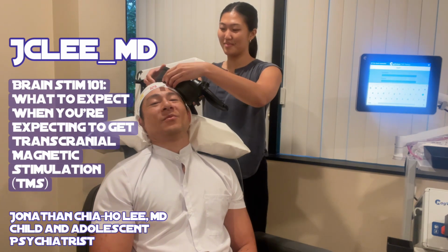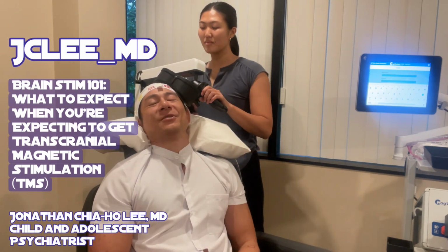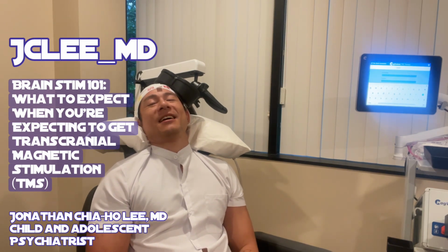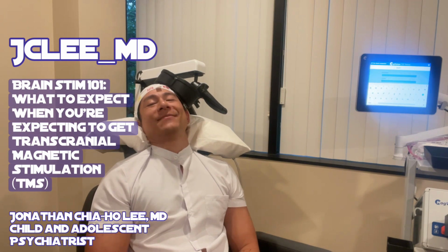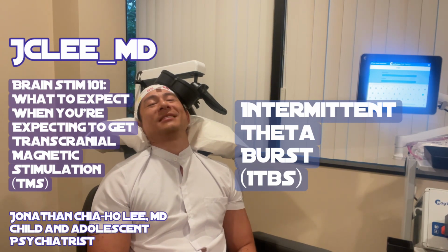At this position, we're anticipating that as the electromagnetic energy, or the electricity, goes through the coil, we're going to generate a perpendicular magnetic field that will then penetrate my skull, again, transcranial, right? And deliver treatment to a depth of about 2 centimeters, really just tickling that outer cortical, bark-like layer of my brain. And because I am real, like Jennifer Lopez, I'm gonna turn the machine on and you guys can see what it sounds like, and you can see that this is actually pretty doable. As you can see, I'm getting what is called intermittent theta burst stimulation right now over my DLPFC.